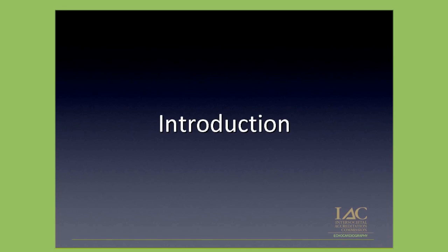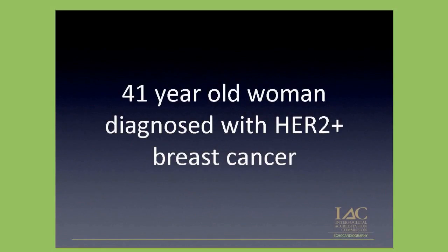So let's go ahead and get started. Let's start with a case. It's always about patient care. This is the case of a 41-year-old woman diagnosed with HER2-positive breast cancer. As part of her pre-evaluation prior to receiving this medication for treatment, which can be anthracycline followed by Herceptin, she is asked to visit our echocardiography laboratory for evaluation of her left ventricular ejection fraction.